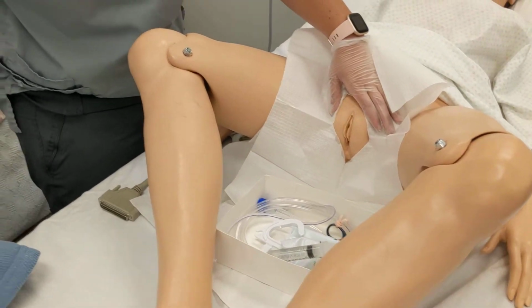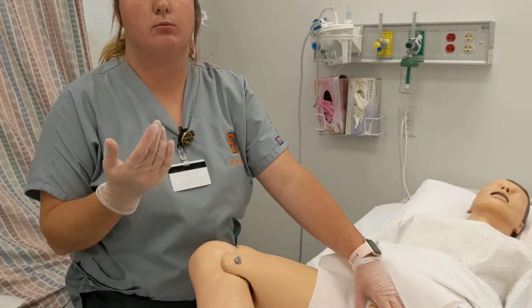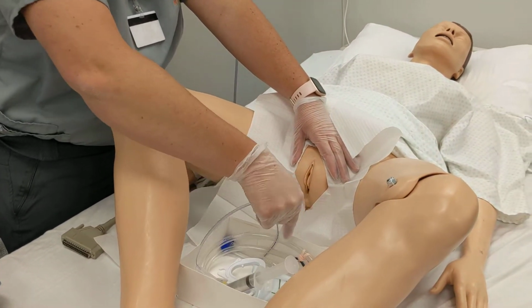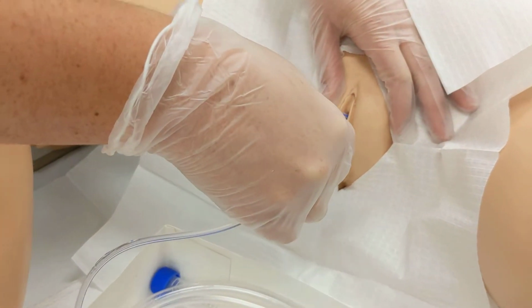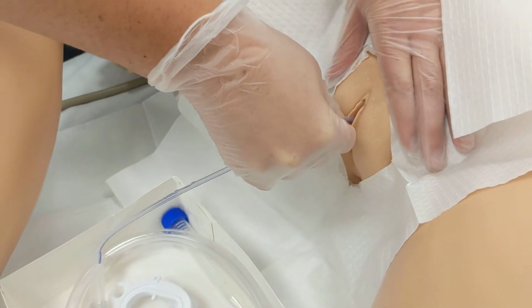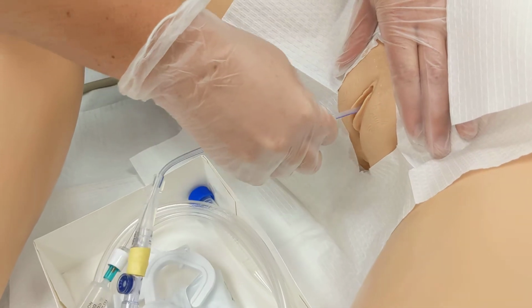Okay, so now I'm just gonna explain to the patient, just to void down, take deep breaths, and I'm going to now insert the catheter. And I'm not going to force anything. Just gonna gently put it in. I'm not feeling anything that's blocking.